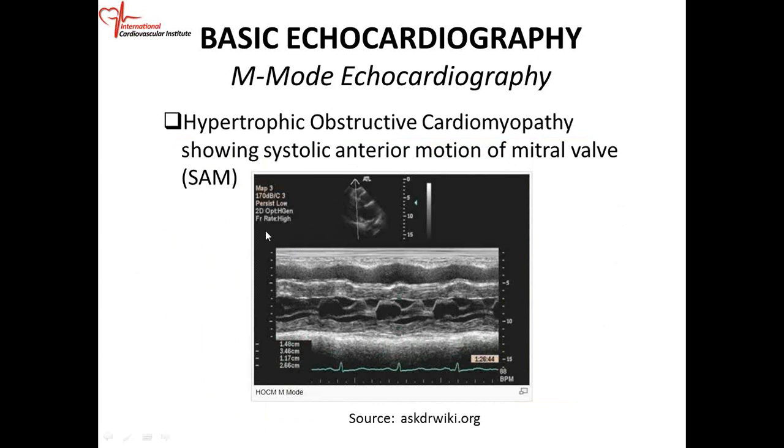Okay, you can see they give you the scale. Each of these little markings is 1 centimeter. So you can measure. This septum is very thick. Okay. So you have the mitral valve inside the LV cavity down here. You have your ECG there. They didn't put the ECG for cosmetics, so you use the ECG.